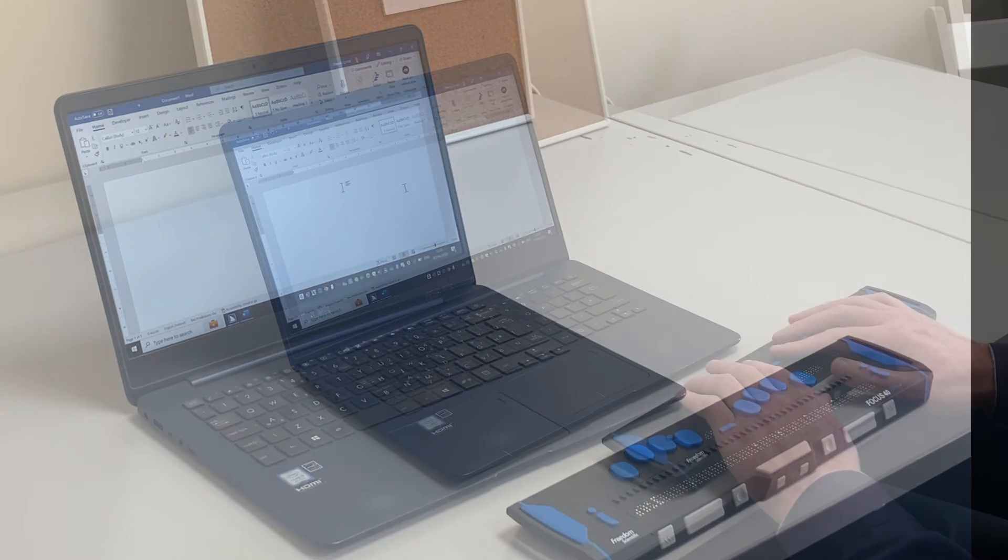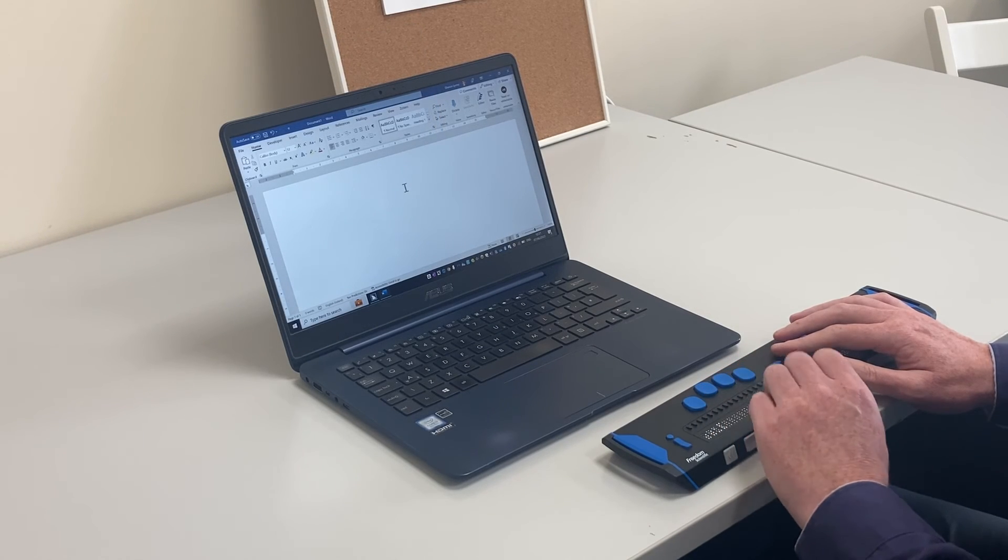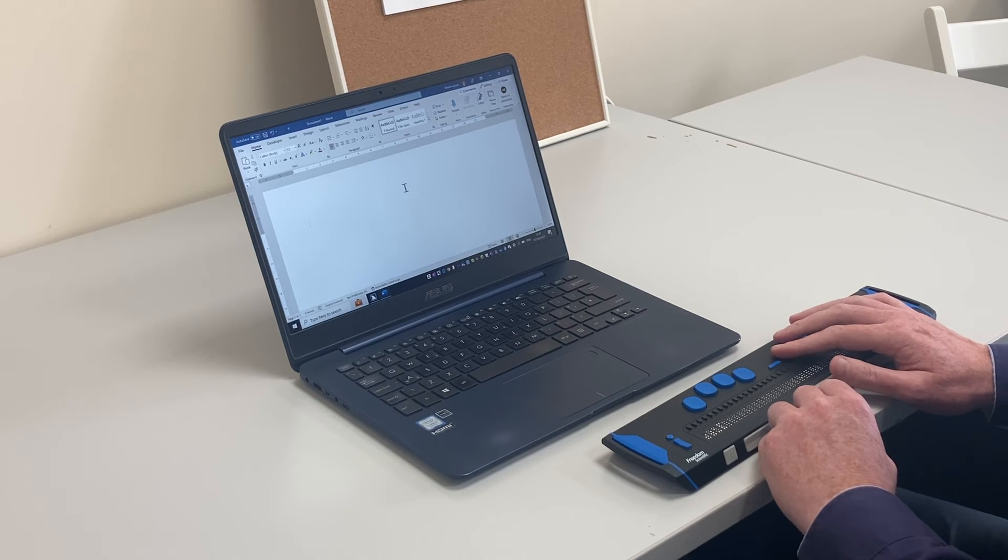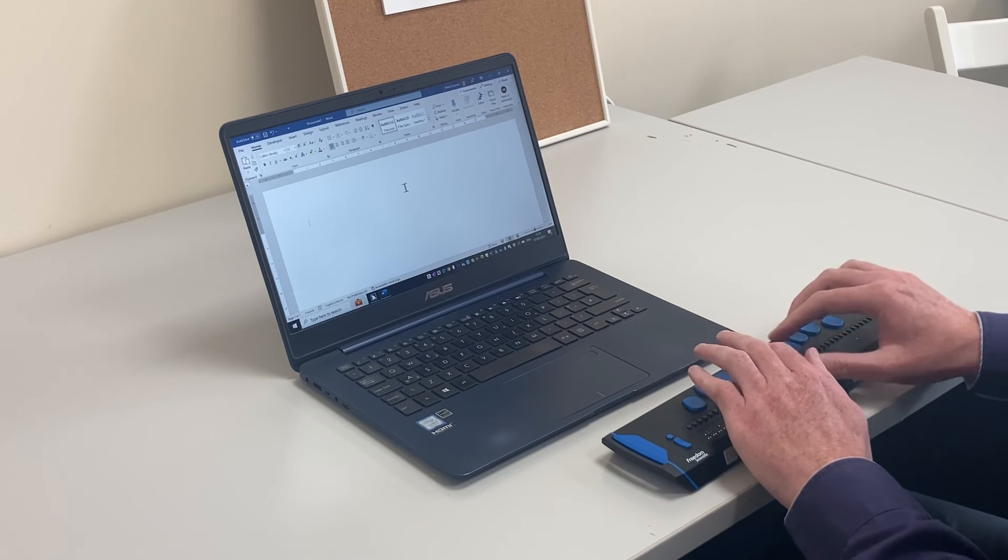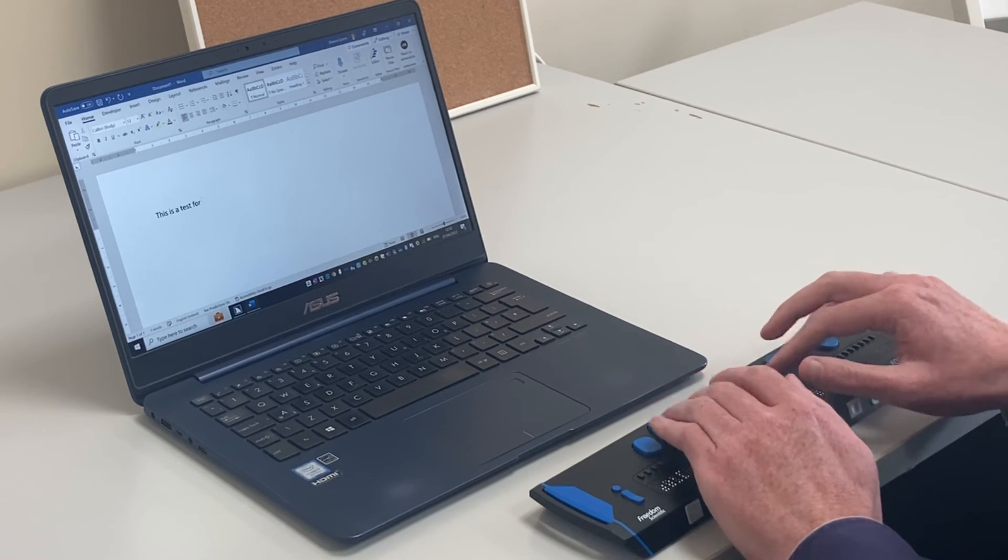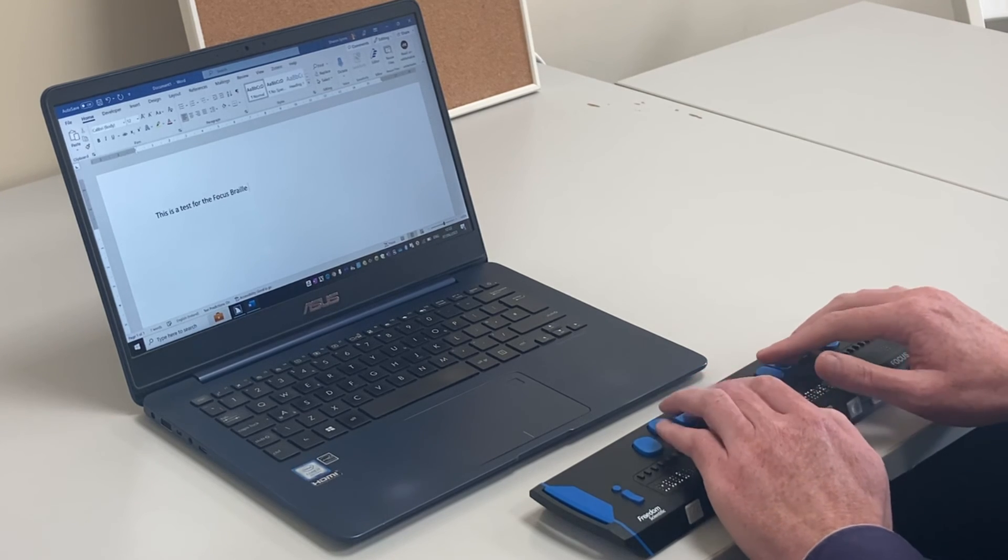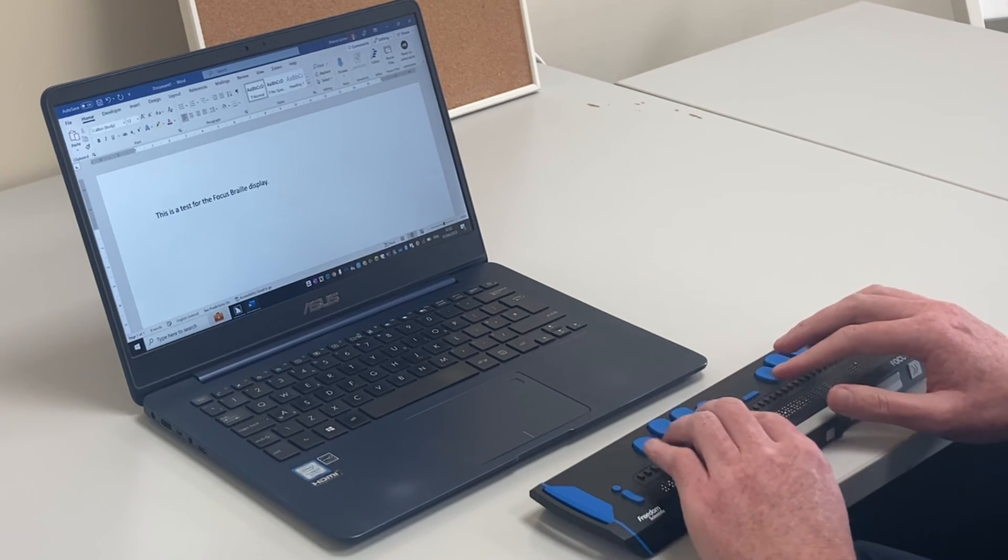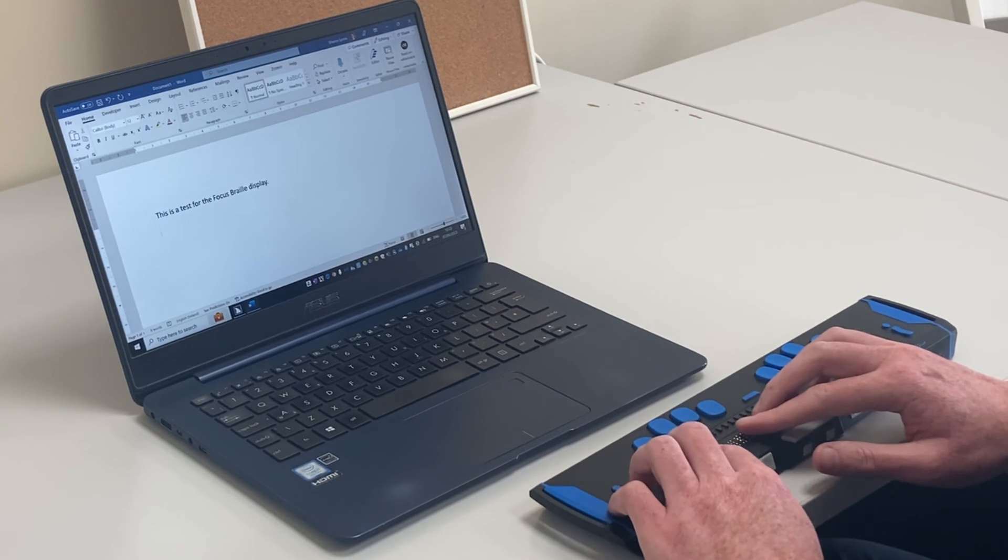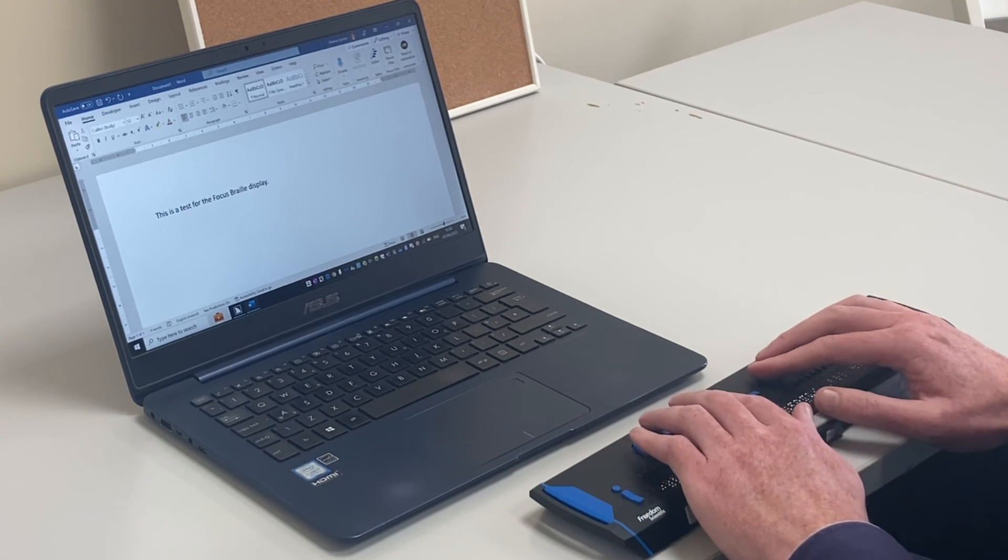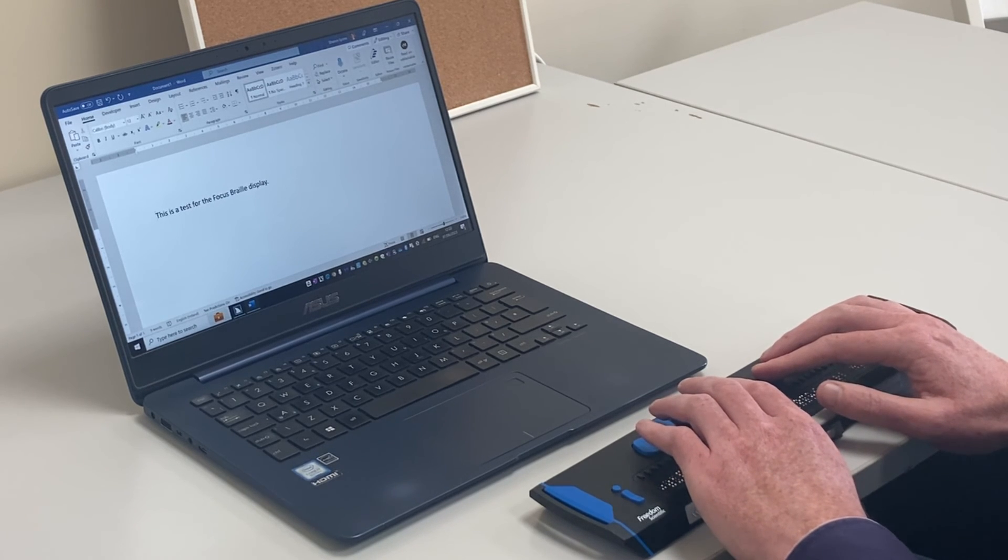So the first thing I'm going to do is show you how I can type in Microsoft Word in contracted, unified English Braille. JAWS is doing all the translation in the background. I can use the panning buttons on my Focus display to review what I've written. And I can also ask JAWS to read it back. This is a test for the Focus Braille display.